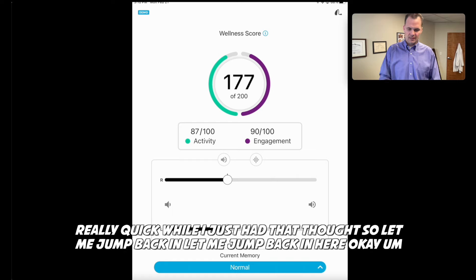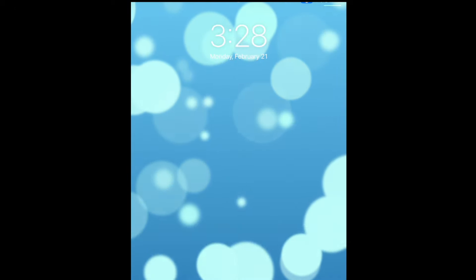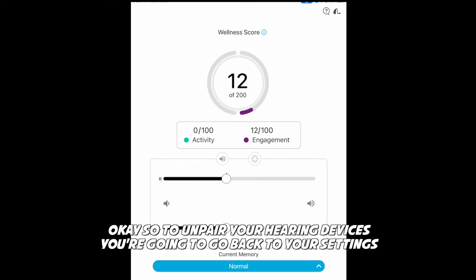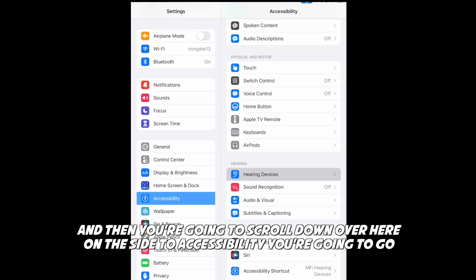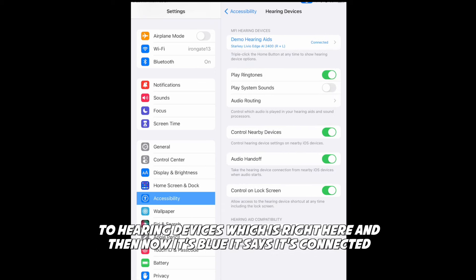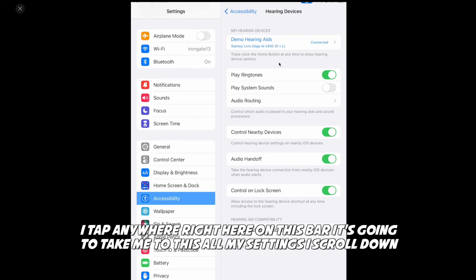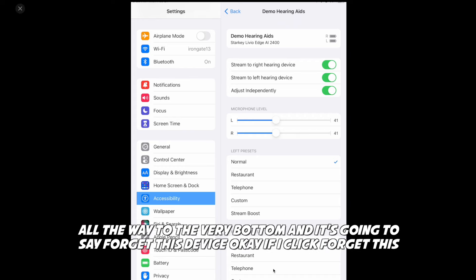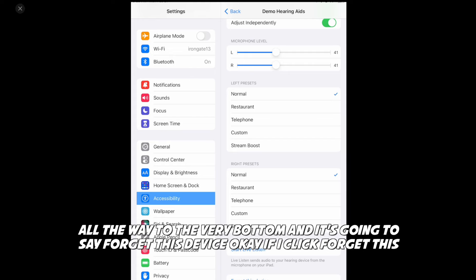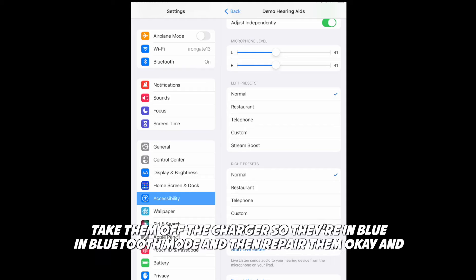Let me show you that really quick. To unpair your hearing devices, go back to Settings and scroll down to Accessibility, then go to Hearing Devices. Now it's blue, which means it's connected. If you tap on that bar, it takes you to all your settings. Scroll down all the way to the very bottom and it's going to say Forget This Device. If you click Forget This Device, it's going to forget your hearing devices. Then put them on the charger, take them off — they're in Bluetooth pairing mode — and repair them. And that's how you do that.